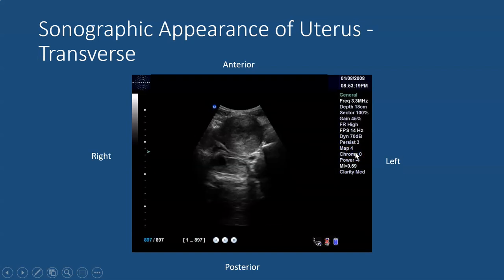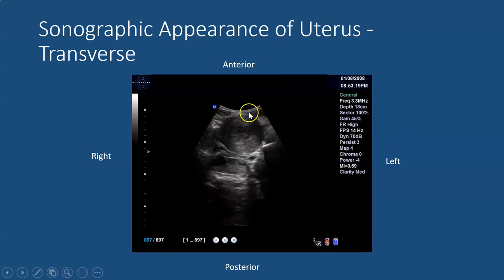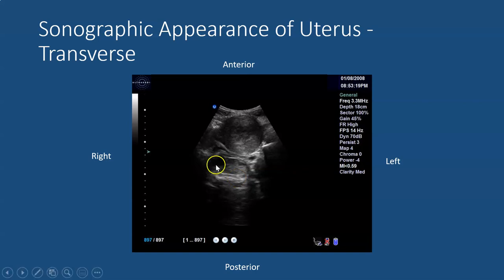Another image — this one where you cannot see the bladder because it is undistended. Instead one can see the uterus, which is the circular structure fairly anterior in our image, and just behind it you're actually able to see the ovary with a small follicle. Again the indicator is towards the patient's right, therefore this aspect of the screen is the right side of the patient and the area away is the left side of the patient.